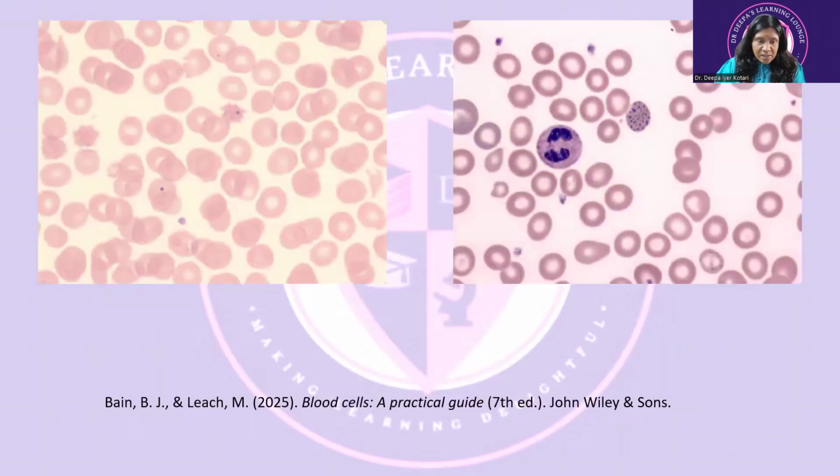If you look at this image on the left, what you're able to see are small pimple-like dots on top of an RBC. They look like they're stuck on. This on the left is a blood film of a patient who had a splenectomy after autoimmune thrombocytopenic purpura, or ITP, showing one Howell-Jolly body. What you're able to see here, like a small dot or a pimple on the RBC, is a Howell-Jolly body. There you can also see some acanthocytes here and there in this peripheral blood film.